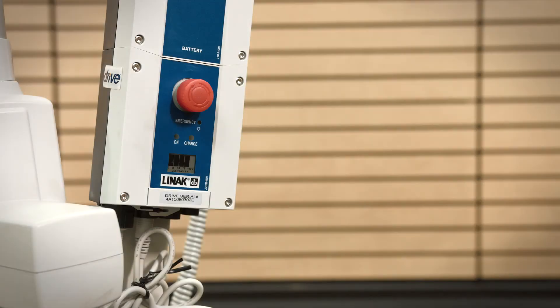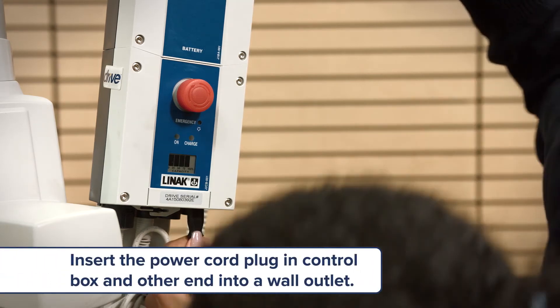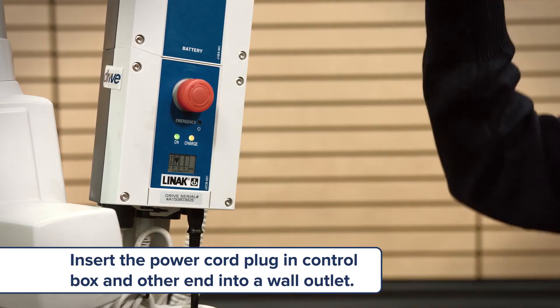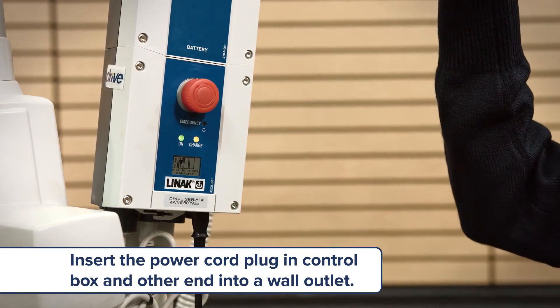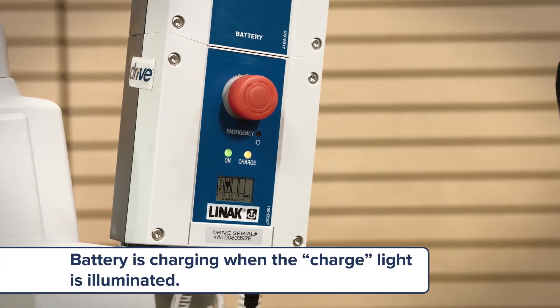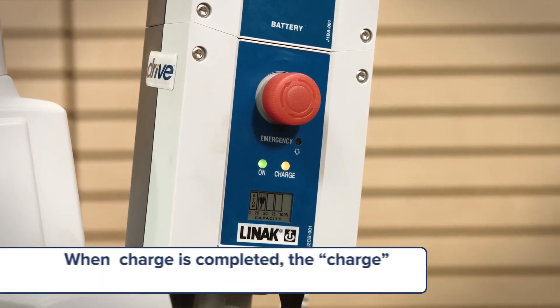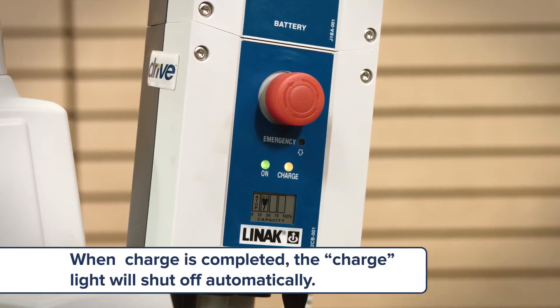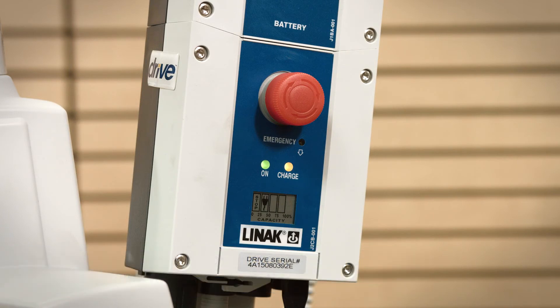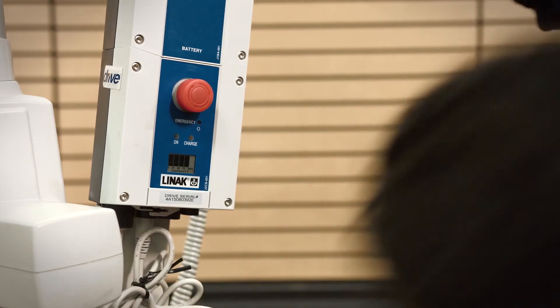Here's how to charge the battery on the bariatric patient lift. With the battery box, control box, and actuator assembled, insert the power cord plug into the control box and the other end into a wall outlet. The battery is charging when the charge light is illuminated. When the battery charge is completed, the charge light will shut off automatically. On average, it takes approximately four hours to charge from 50 percent to 100 percent. Remove the power supply cord — the lift is now operational.